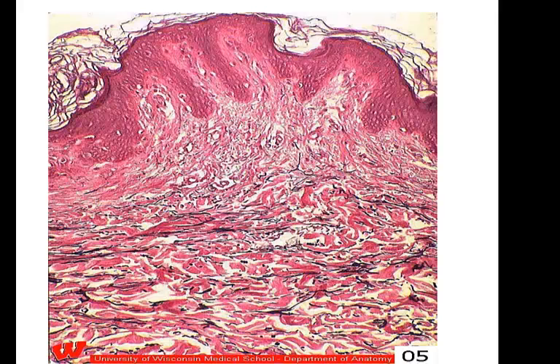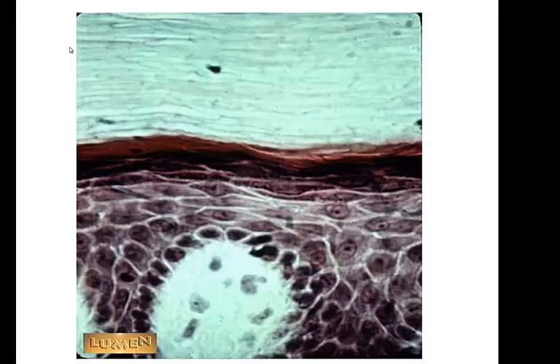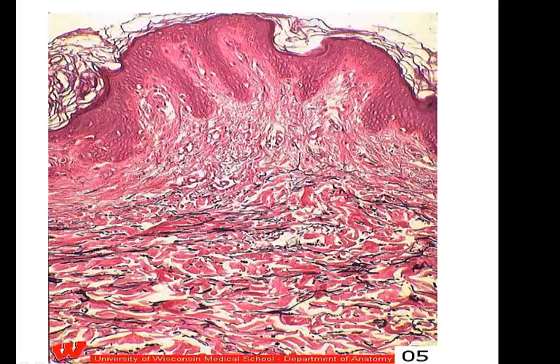It looks way different, doesn't it? And you're thinking, well, it doesn't look anything like this slide. It doesn't. From here out, this would be keratinized stratified squamous epithelium, but the difference is these cells right here are compact and they're not scaly like these. They are not ready to shed.